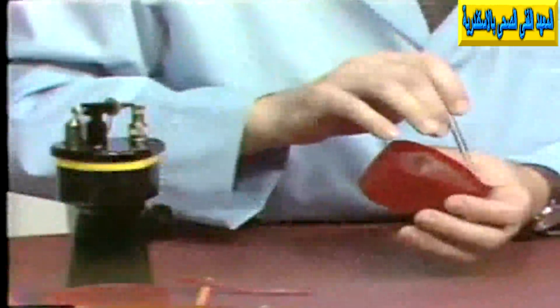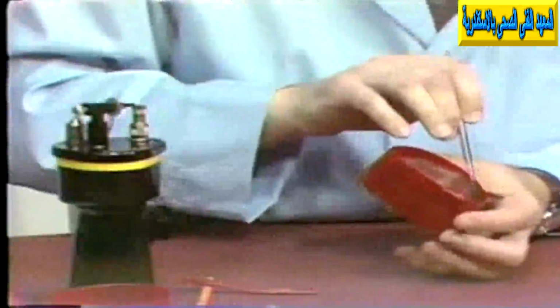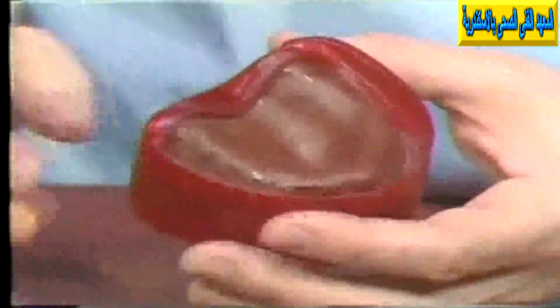Now, because we have worked with this wax and the wax is quite soft, the last step that is necessary before we cast the impression is to pour some cold water in this, and this will make the wax rigid once again, and will hold the desired shape that we want for the master cast. That's all it takes to seal the impression all the way around. Now we have a boxed maxillary impression.